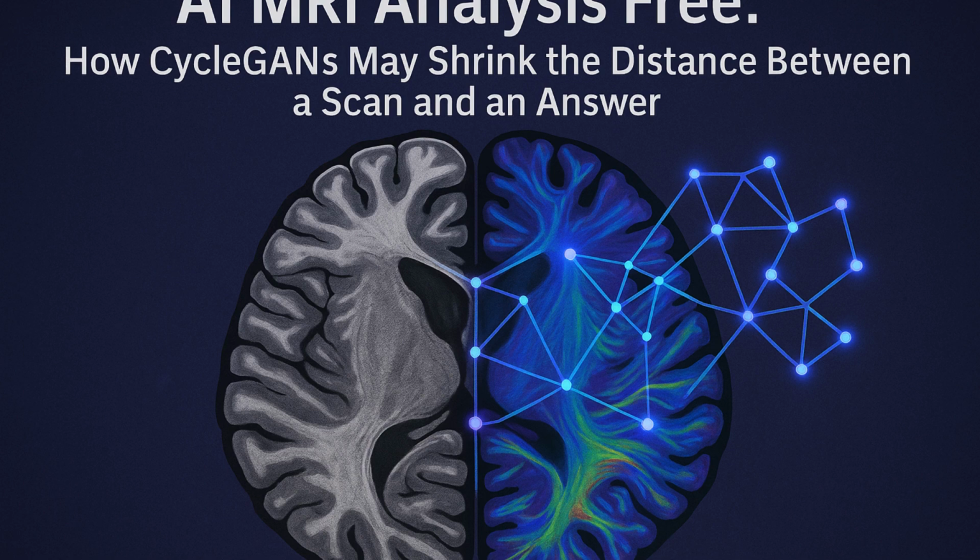Okay. So this is where the CycleGAN approach gets really interesting. It basically aims to generate these FA maps from the routine T1 images. The ones that are almost always done in a brain MRI. Exactly. The standard stuff. So how does this Google Translate for voxels thing work? Because that's how they described CycleGANs, which I thought was pretty clever. It's a really helpful analogy, actually. Imagine you have two different languages. In this case, one MRI image type, T1, and another, FA. Normally, to translate, you'd need lots of paired examples. The same brain scan both ways at the same time. Which isn't always practical.